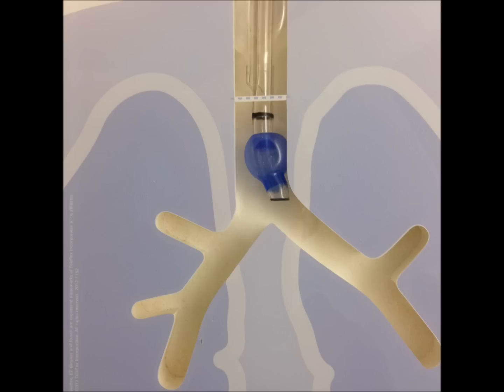Keep the bronchoscope in the room because you will confirm the placement, and once it's confirmed, then you're good to go. Here's another example of a left-sided tube that has come out too far — you really just need to deflate both cuffs and advance the tube.